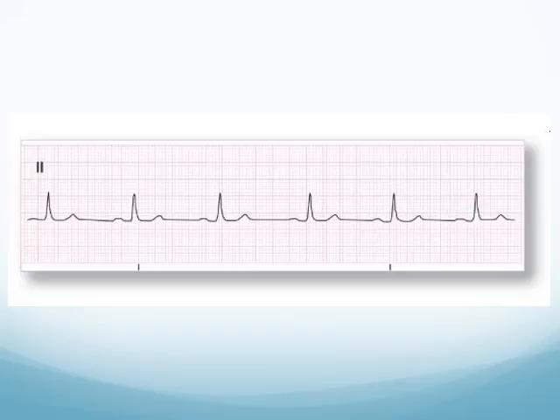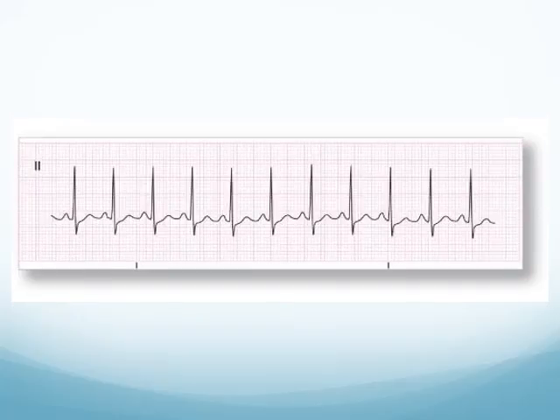There doesn't really appear to be anything else sticking out, so we have another sinus bradycardia. Our rate looks like it's right at borderline, right at 60. So it could be a sinus rhythm or sinus bradycardia. So we need to determine our rate.